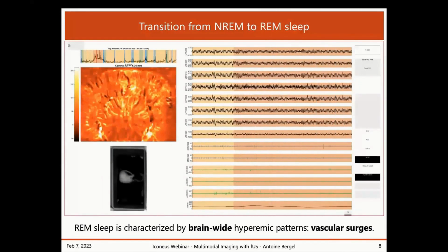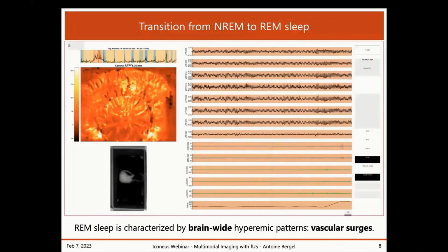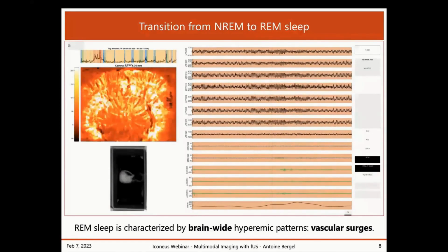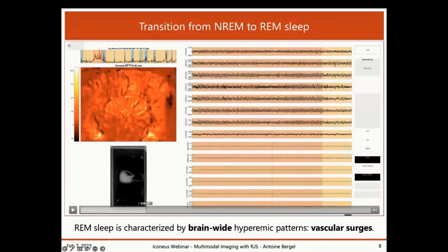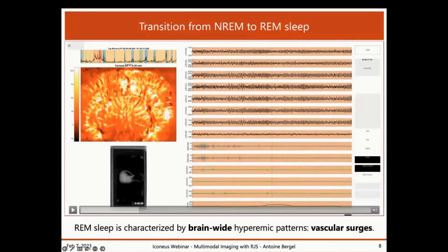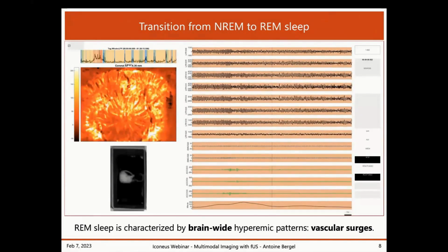And now you will see that it's not constant. There are pushes, moments where the vascular activity strongly pushes, like here. And again, here. So when you look closely, actually I'm going to stop the video and go back a few seconds before. Before one of these pushes, you can see that there is something in the electrophysiological activity. Just pay attention here. There's a pattern that we see, and we want to analyze this pattern.